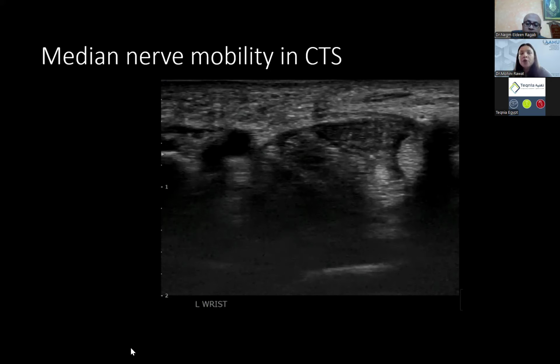So I don't use them as an absolute measure, but the more you see loss of that honeycomb texture, this nerve is undergoing axonal degeneration. So we know this is at least moderate, if not severe. In some nerves, you can sometimes see complete loss of this echo texture. Those are more severe cases, and that correlates with EMG. You will see loss of the texture and a stiffer-looking nerve. It starts to become more fibrotic. Those will be more axonal injury and more advanced changes in the nerve. So these features can give you some information on the temporal course of this abnormality as you're examining it.